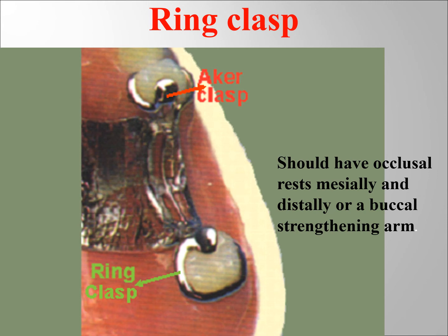The difference is that it has a rest, and the arm goes from the rest on the lingual surface all the way to the other side, and then engages the deepest undercut on the mesiobuccal. Same thing applies on the lower arch. It goes from the rest onto the buccal surface, distal surface, and to the deepest undercut mesiolingually.